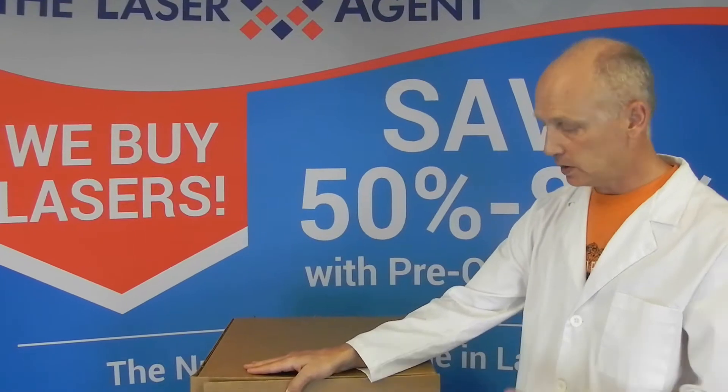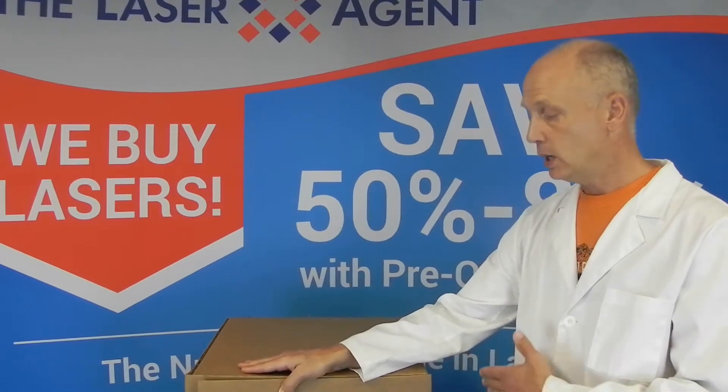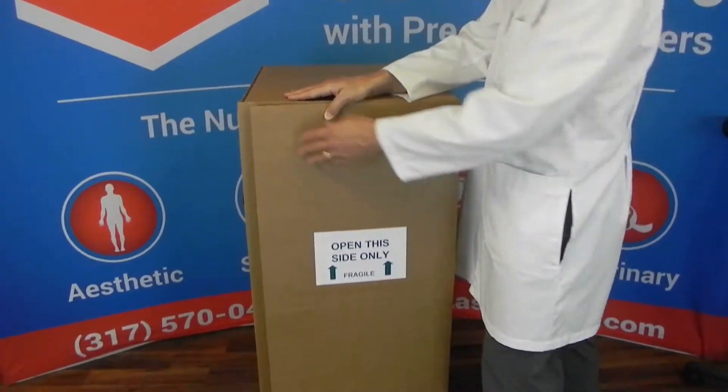Hi, it's Tony with the Laser Agent. I just want to do a quick video to show you how to unpack your laser that arrives from the Laser Agent, whether you're receiving it back when we perform service for you or whether you've purchased a refurbished Luxar laser from us. First, the box will come via UPS.